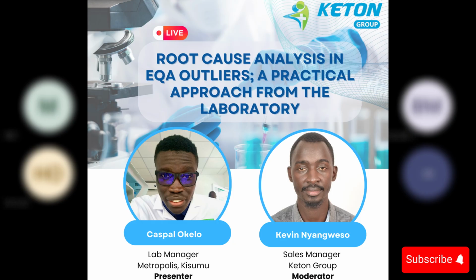So once you've checked if it's an actual bias, you've reviewed your LJ charts, you compare all your 3 control levels. If the bias is present across all the levels, it might be a calibration issue. If it's present only on one level, it might be a control material issue. So you need to distinguish very well if it's an analyzer issue or a control material issue.